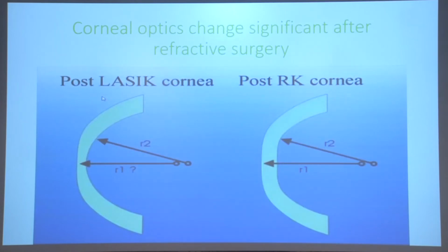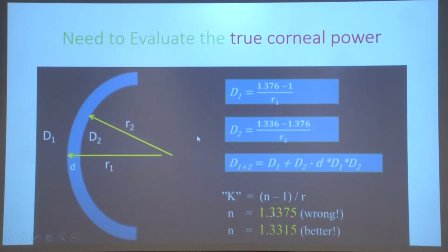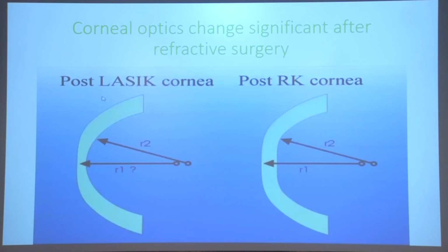What happens in a post-LASIK patient? Well, you all know, this is a bit of an exaggeration. It is not such a top hat in these prolate cornea days, but I am just trying to explain that this ratio is changed.